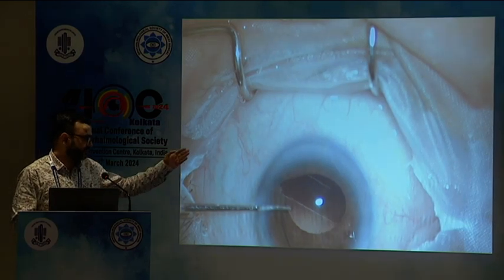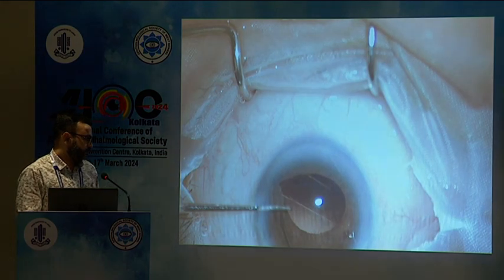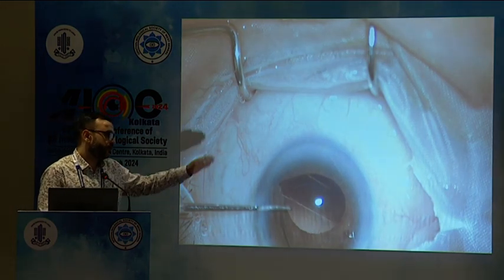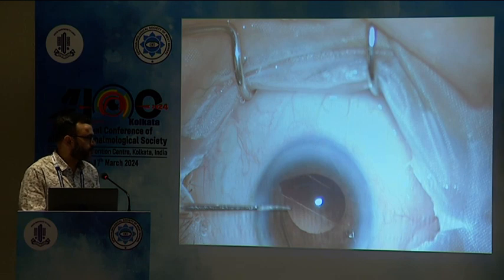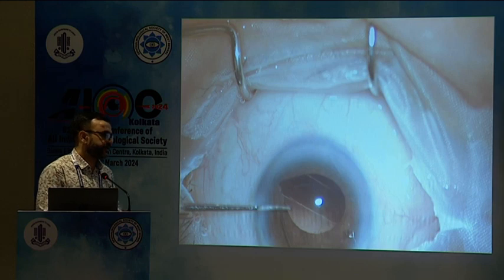If it was because of the stretching by the CTR ring, it would have occurred longitudinally. And usually the CTR does not stretch, it evenly stretches the bag. So the appearance of this signifies that probably the leading part of the CTR ring is out of the bag.